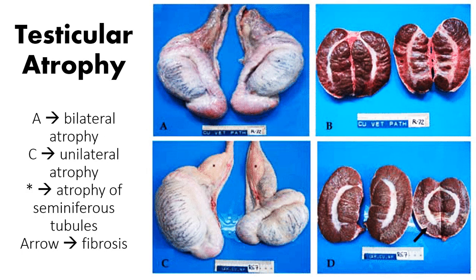Here, this is the atrophy of the cells. It can occur in certain organs. Here, you can see examples of atrophy of the testis. In front of you is a testis. I guess this is a testis from a dog.